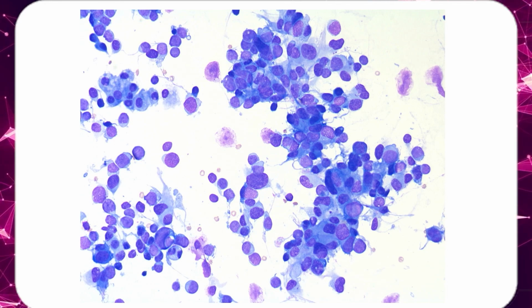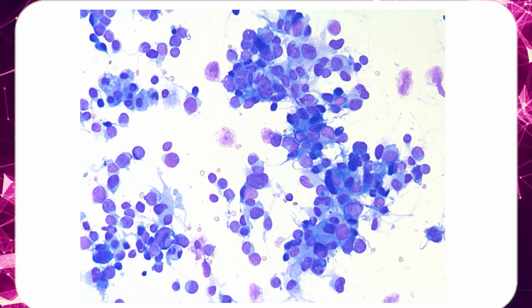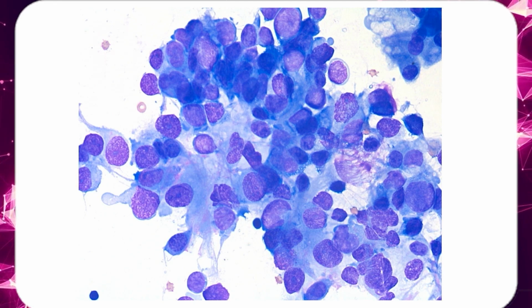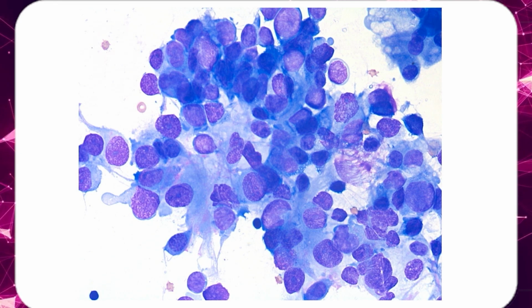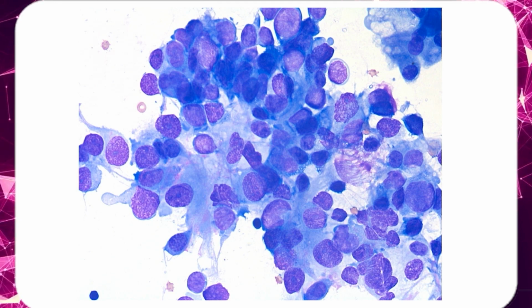So again, quite pleomorphic, some binucleation, a little bit of cytoplasm here, very basophilic cytoplasm, some cytoplasmic tails, macronucleoli, but overall, a discohesive or loosely cohesive pattern is seen here. Now you can see even some suggestion of gland formation, high NC ratio, cytoplasmic tail, but too much cytoplasm even for an anaplastic large cell lymphoma, which certainly can happen in post-transplant lung.